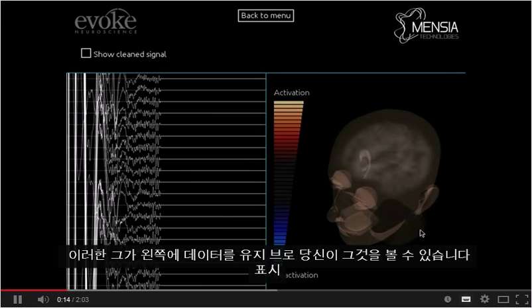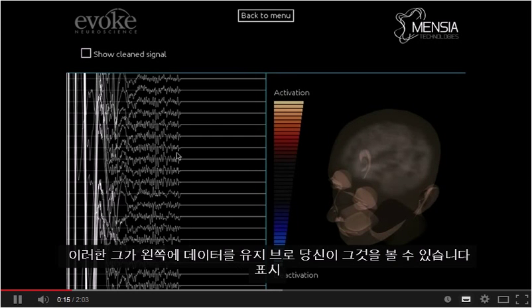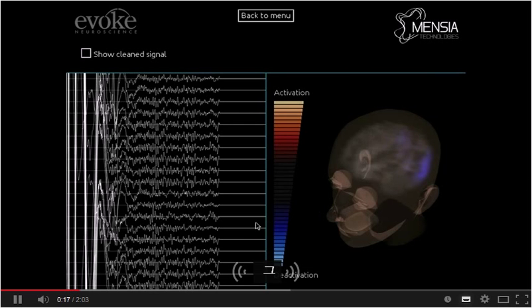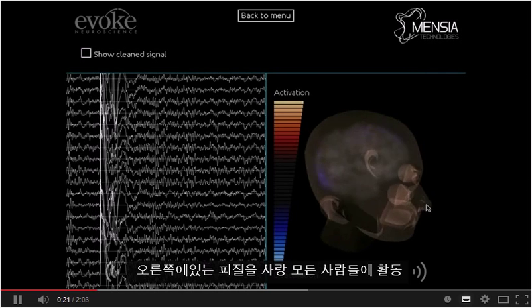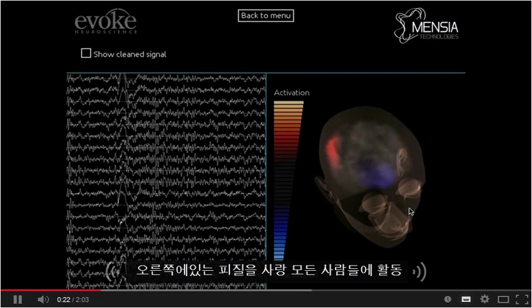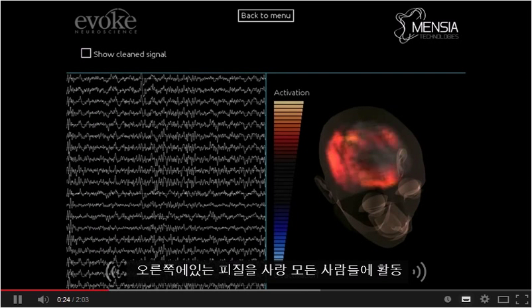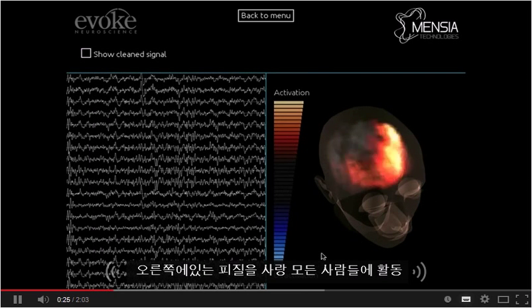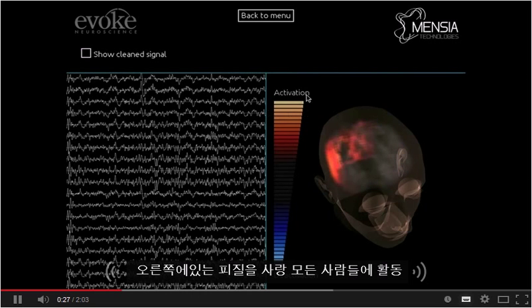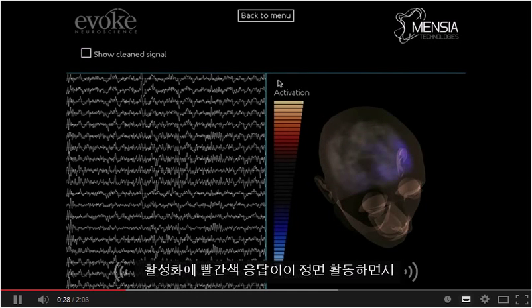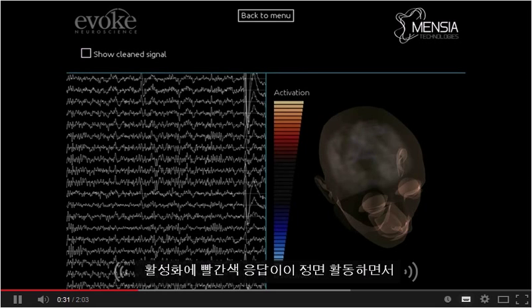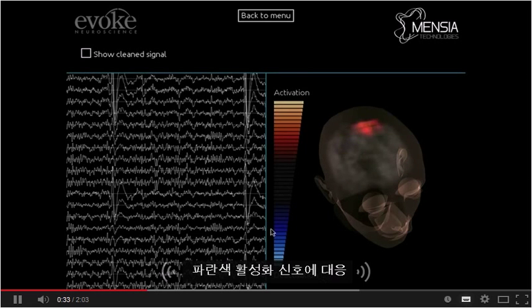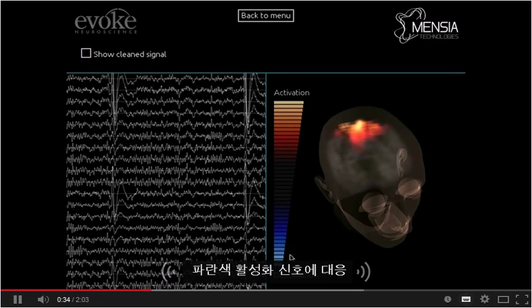On this display, you can see the raw EEG data on the left, and a reconstruction of the EEG activity in every voxel of the cortex on the right. Red corresponds to an activation of the cerebral activity, while blue corresponds to the deactivation of this signal.